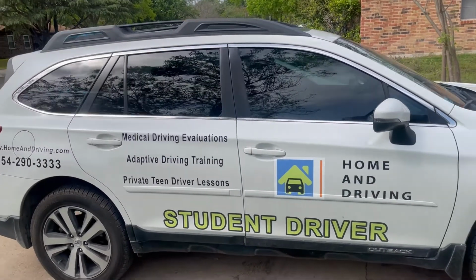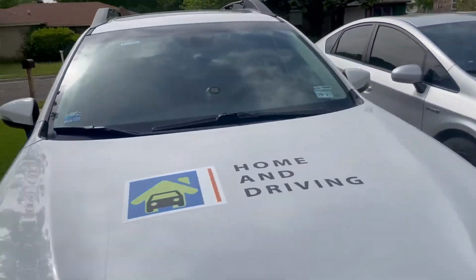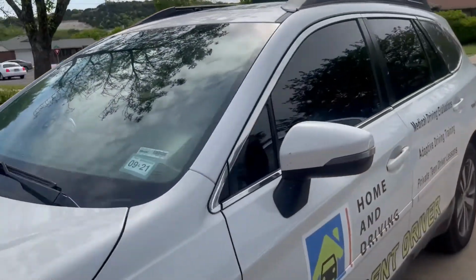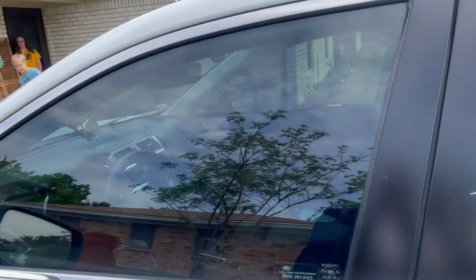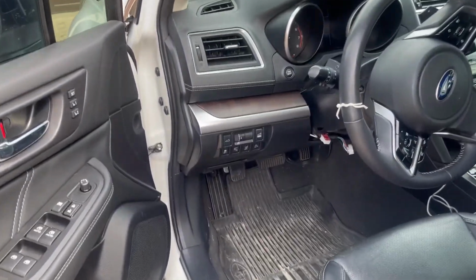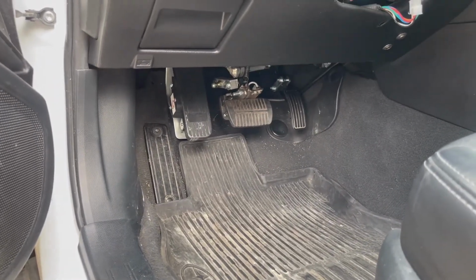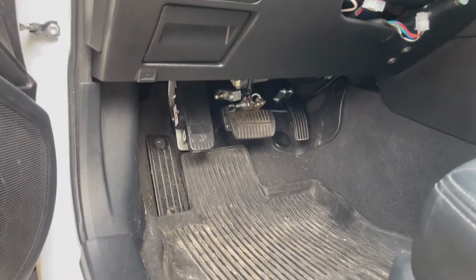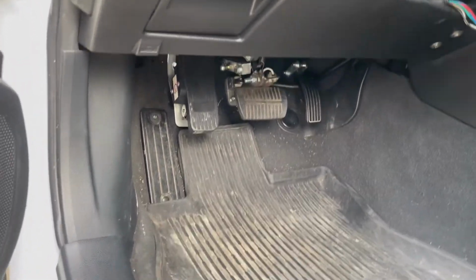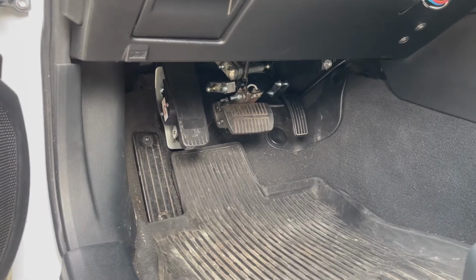All right, everybody, so this is my car. Like I said, it's a Subaru Outback. We're going to hop in and I'm going to give you a really brief tour. It's set up like most Outbacks. Down here, you'll see three pedals. The one on the left is a left foot accelerator. We primarily use it for clients that maybe have a spinal cord injury, neuropathy, or amputation.